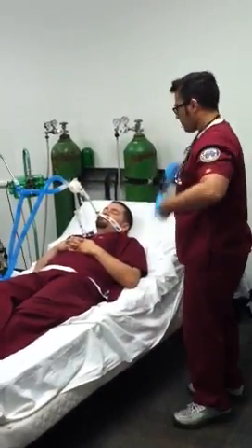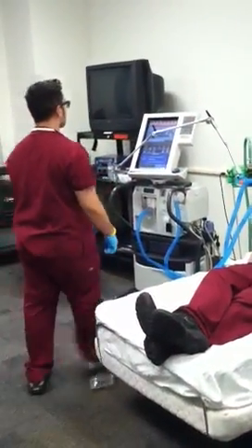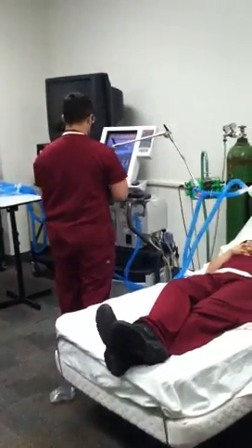Next, he monitors the ventilator: performs a ventilator check, assures correct settings, and assures a properly functioning humidifier.